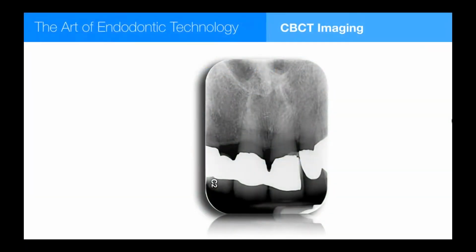Periapical films, our 2D periapical films, have been the standard that we've depended on to make our diagnosis and treatment planning, little realizing that at least 30% of all the pathology that our patients have around their teeth is not going to be represented. And so now that we have CBCT imaging, it's a whole different story.